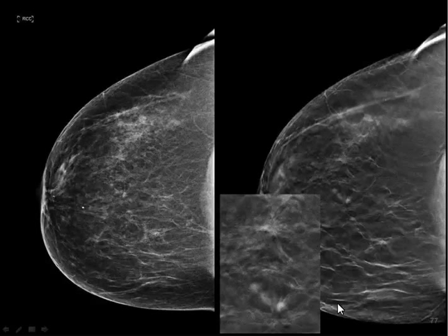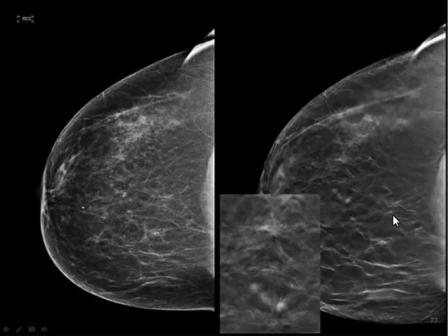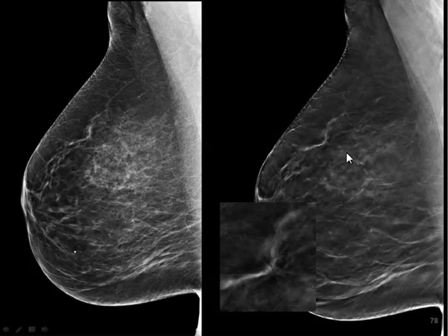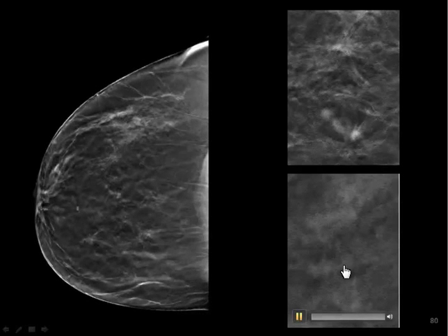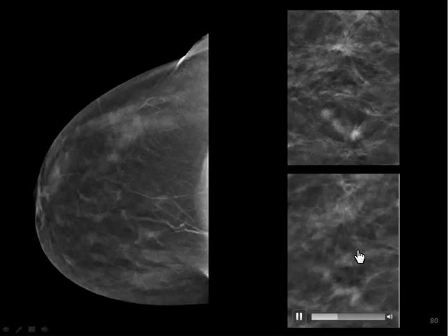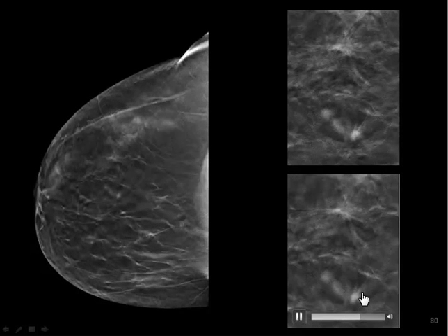In the right breast — and I'm showing you some very subtle cases — the nice thing about tomosynthesis is that a subtle finding on standard 2D has a high probability of being benign, whereas a subtle finding on tomosynthesis has a much higher probability of being malignant. Here we can see just a subtle area of architectural distortion, and here's a second area. On the CC view, there's a little line of subtle lesions — that's one, and that's the other one.